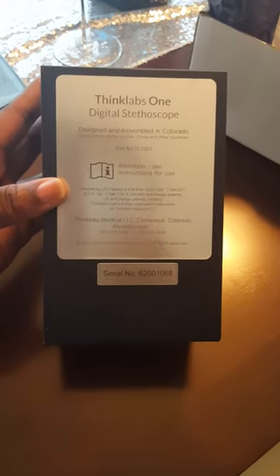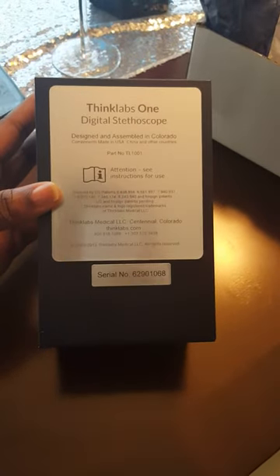It was sealed up. I just cut the tape off. There's a logo on the outside and the back basically says it's made in America, which is cool.